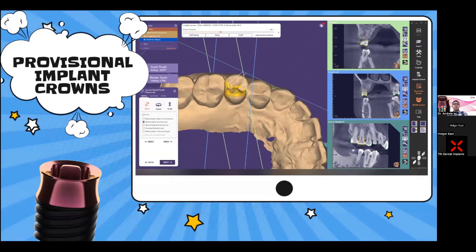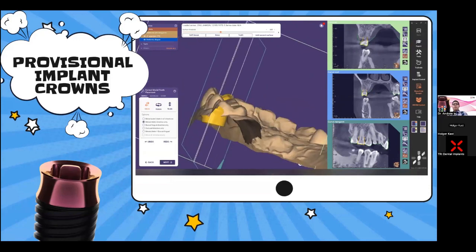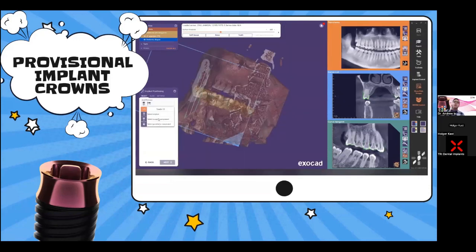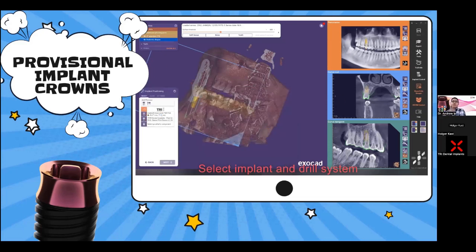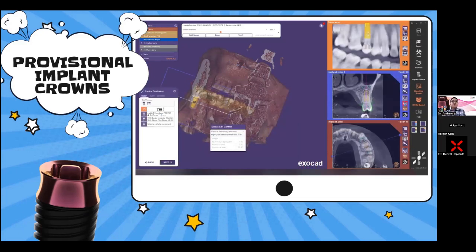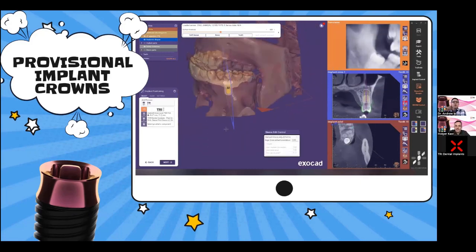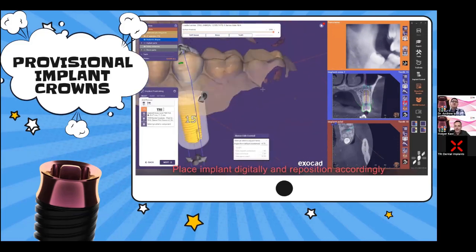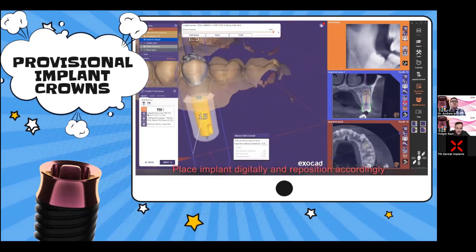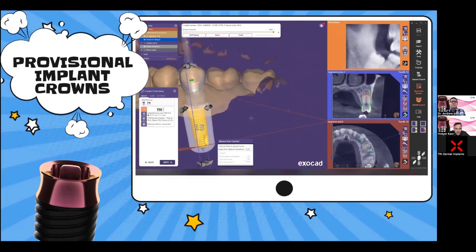There's one question: why you have to create a wax up if you have... Yeah, actually, to be honest, I could have skipped that part, but I was already recording, so I just put the tooth there. It doesn't really matter, to be honest. Like, you can skip that part completely. It just automatically happens when you follow the workflow on exoplan. Yeah. But you don't need to. Yeah, because the tooth is already there.